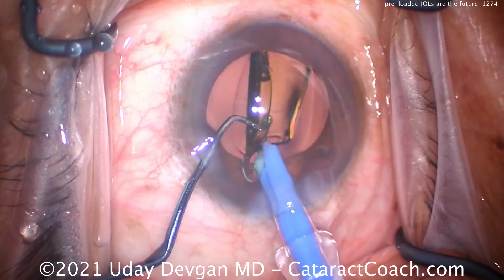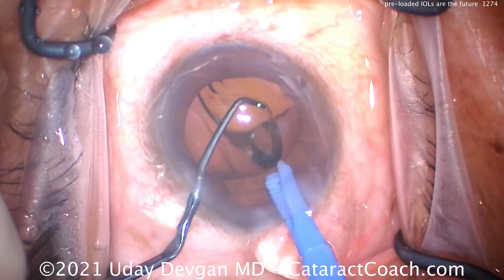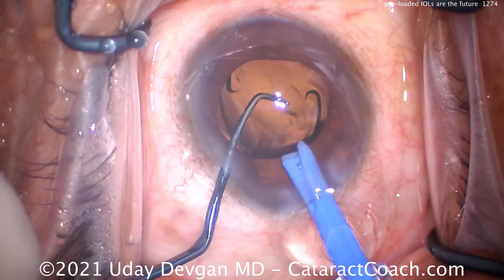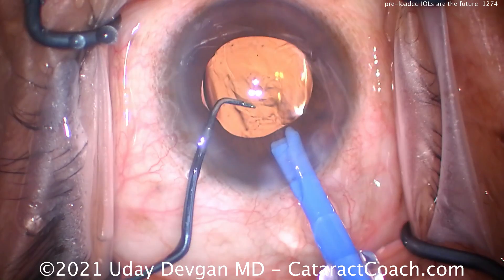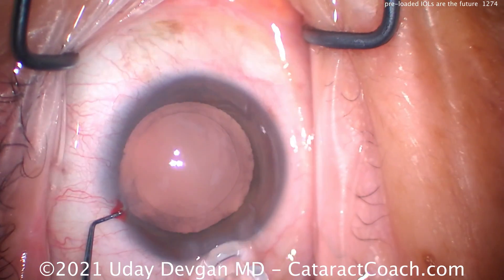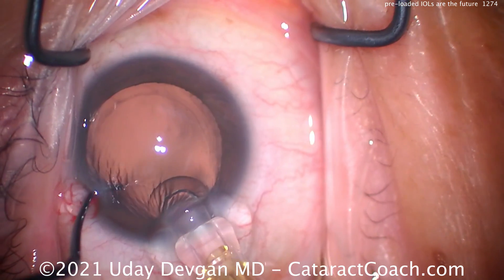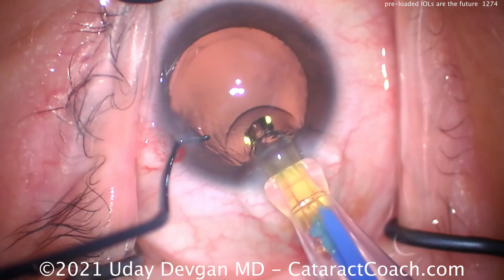This is the new injector from Alcon, the Clarion, that has a little mini CO2 cartridge in the injector itself. There's a trigger for your index finger to push down on, and that releases the gas in a very slow and controlled manner, and this lens comes out very smoothly — no twisting or pushing or plungers needed.